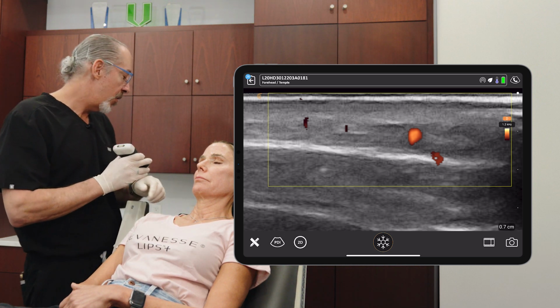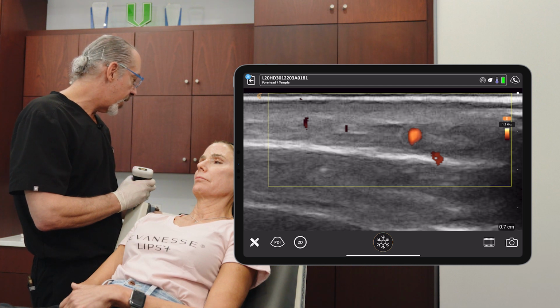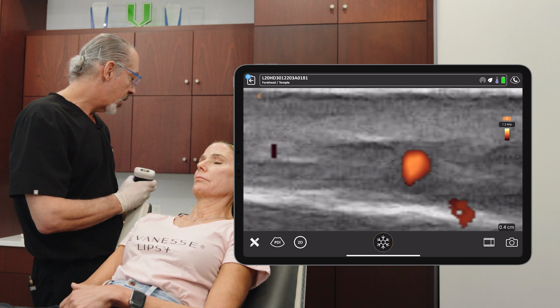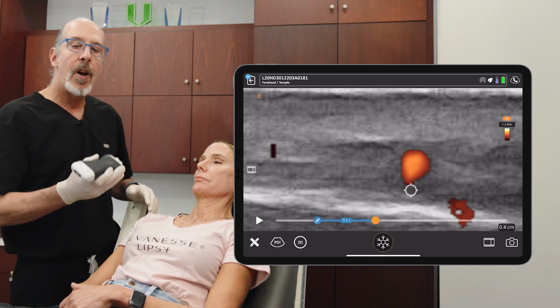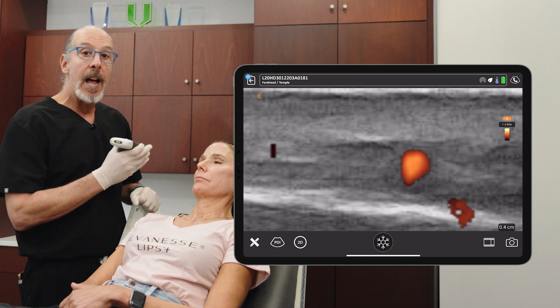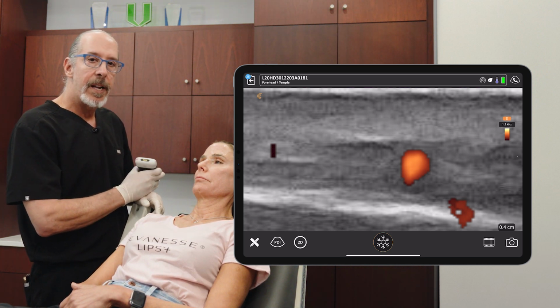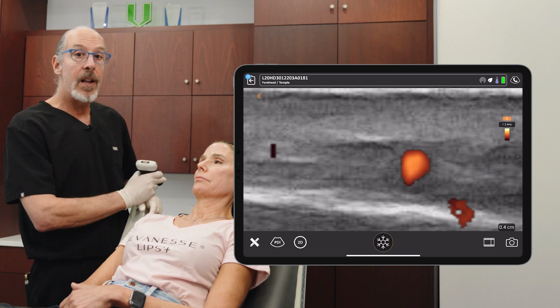And I want to show you how the artery here is just beneath the skin surface, which is here. You see the lowest part of the dermis, and you see it's very, very close to the lowest part of the dermis, with the muscle being down here. So as I told you, it becomes almost subcutaneous as you go up into the forehead. So this is the supraorbital artery, subcutaneous in the upper forehead. So that concludes the evaluation of the forehead.